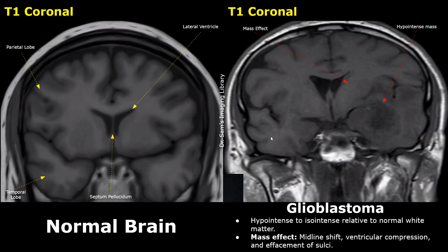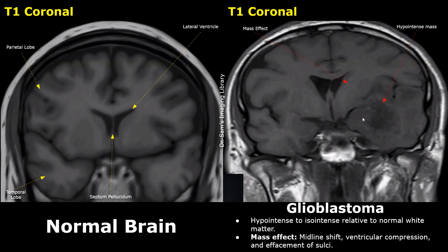These are coronal images of the brain. These are the left and right parietal lobes, and these are the left and right temporal lobes. In the right image, a mass is present in the left temporal lobe — it is hypo-intense to the white matter. It is causing a mass effect and midline shift. Ventricular compression is also noted.